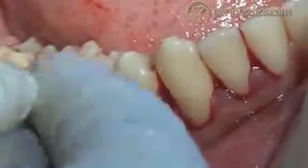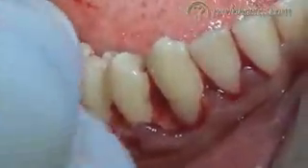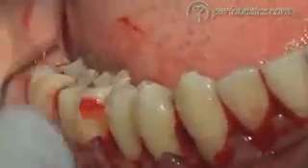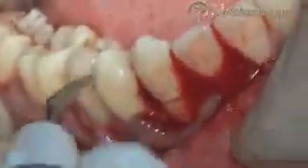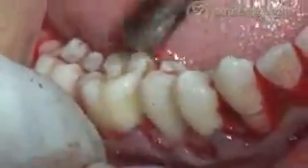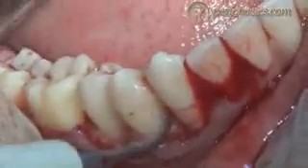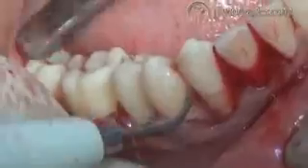And then when we remove the granulation tissue we have to re-inspect the area for any remaining granulation tissue or tissue tags. So all the tissue tags and the granulation tissue is removed. And then we start with the scaling of the teeth. As the root surfaces are clearly accessible to us, we do the scaling. You can see the calculus particles coming out. The root surfaces are scaled and they are made absolutely clean.